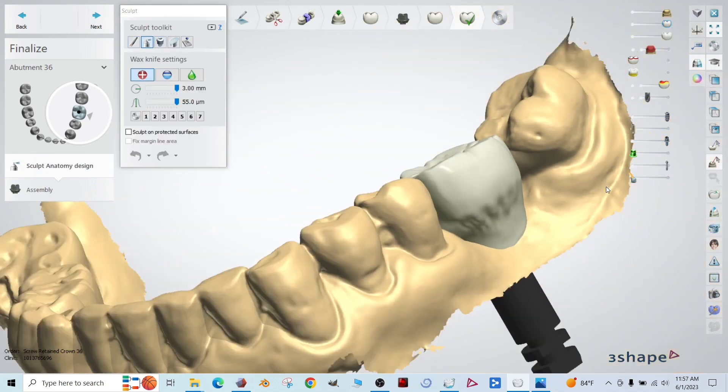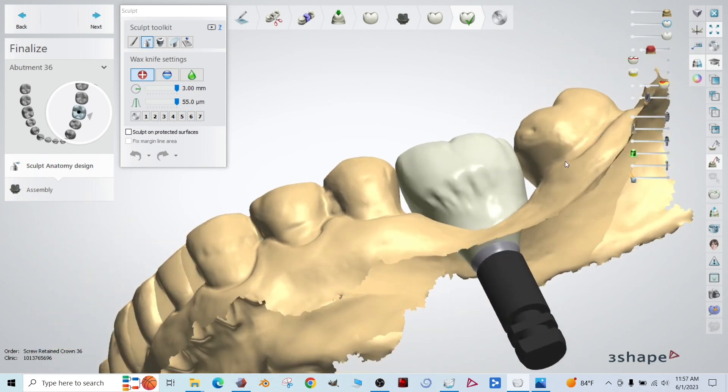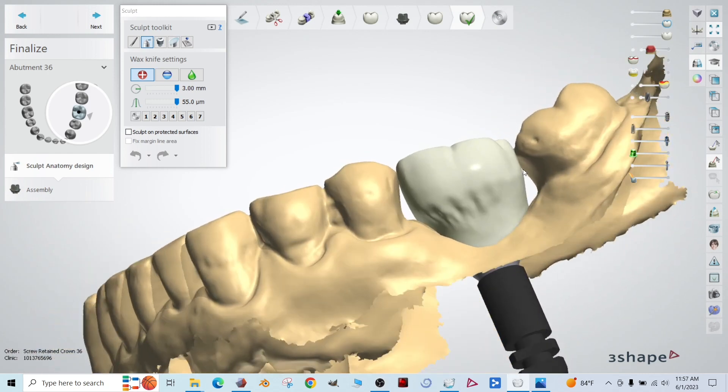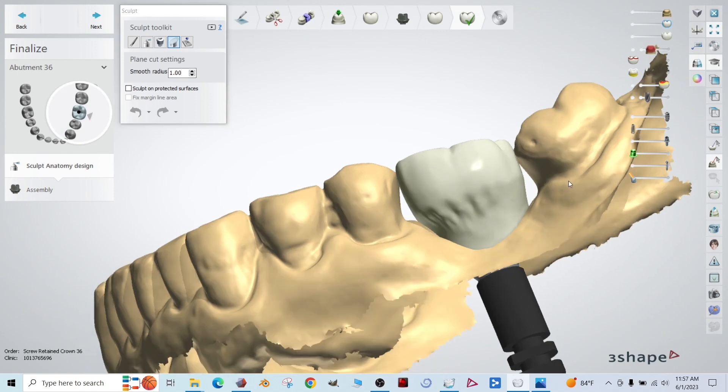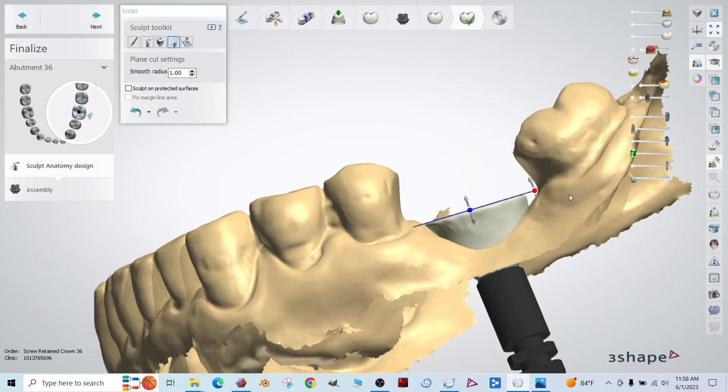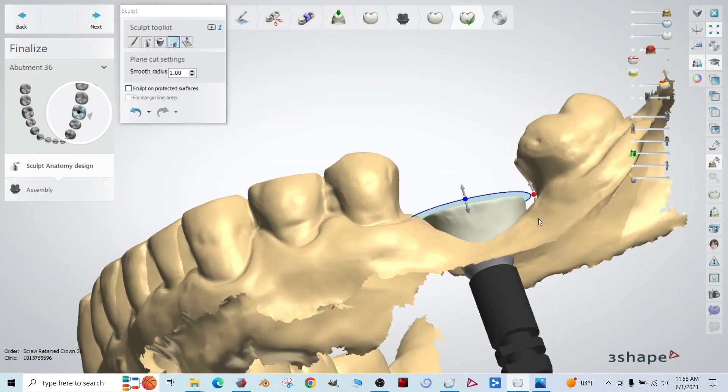All right. Ugly, right? Doesn't matter. We're going to get rid of that. Up here in the upper left, there's this plain cut tool. Go ahead and click that. If your smooth radius is set to a really small value, go ahead and set it to just one. I found that works out pretty well. There we go.